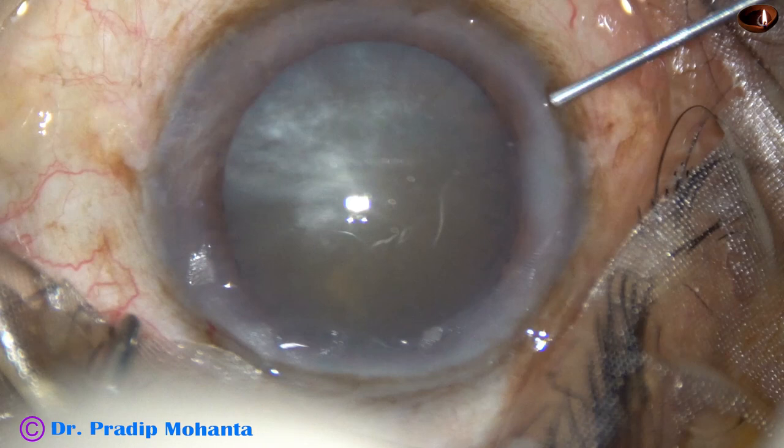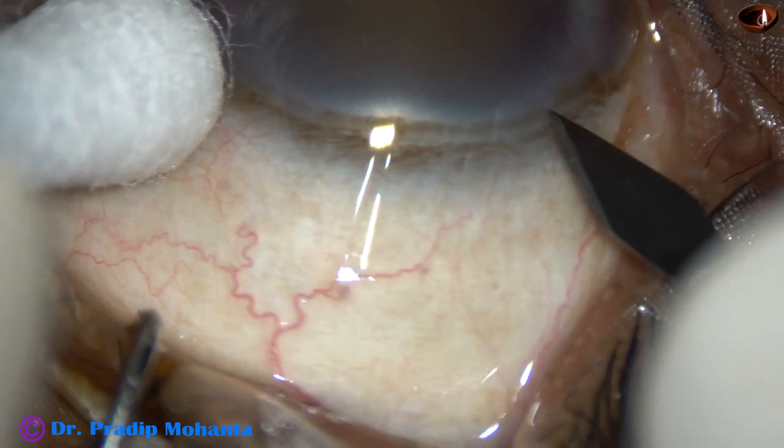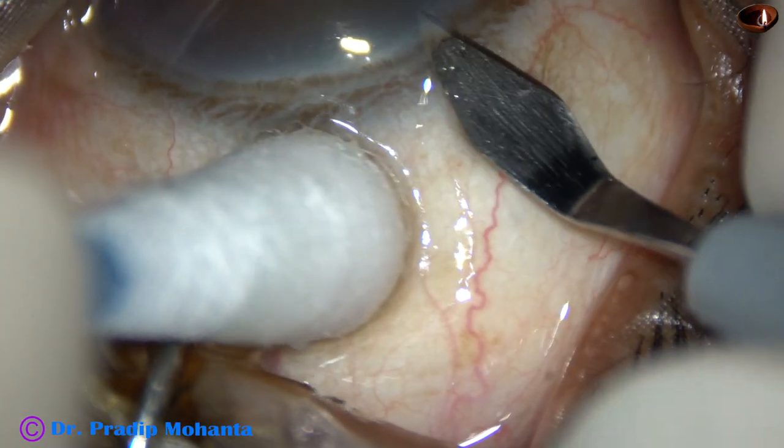This cataract appears like an immature senile cataract, but it is actually an intumescent cataract. Let us observe this surgery.